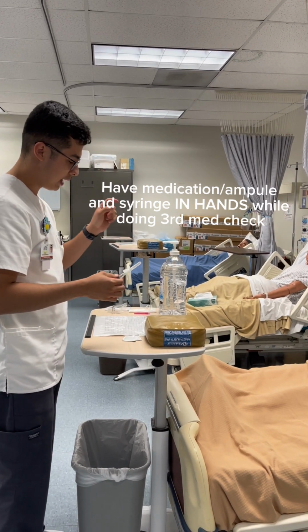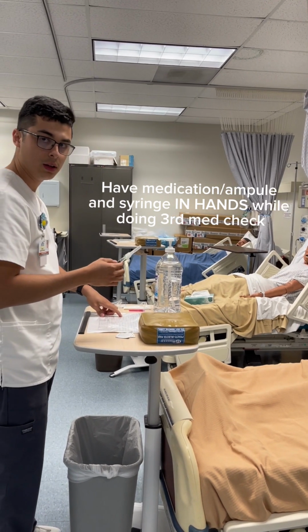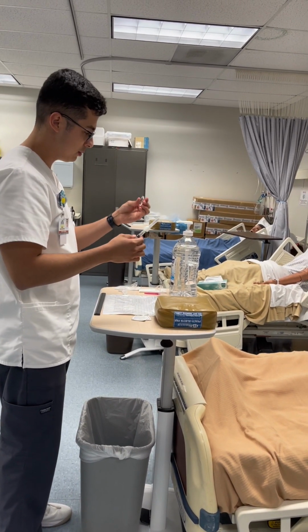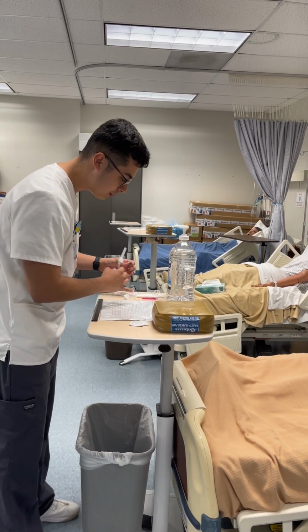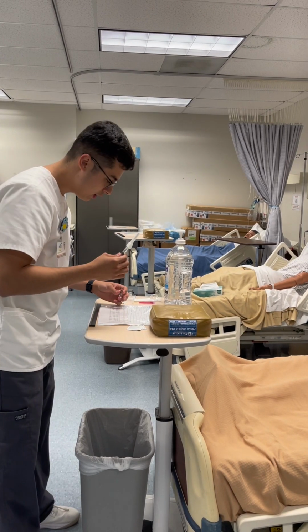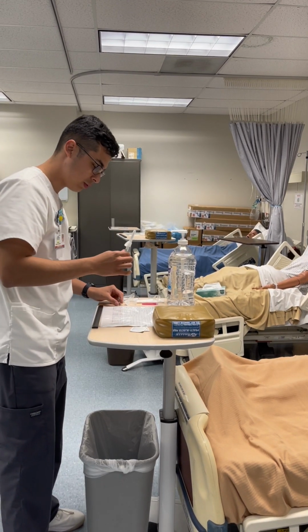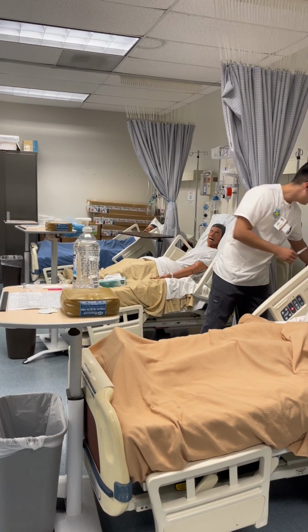I have here my patient Angel Pena. We're going to be giving him his Compazine, 5 milligrams intramuscularly as needed. Actually, you know what? Let me make sure I have my med in my hand. So I have here my patient Angel Pena. We're going to be giving him Compazine 5 milligrams. That came out to 1 ml. This is 1 ml. Intramuscularly as needed for his nausea and vomiting. And right now it is 12:50. So we'll administer that right now. First, I'm just going to grab some gloves.